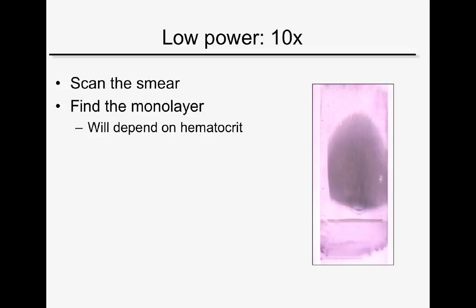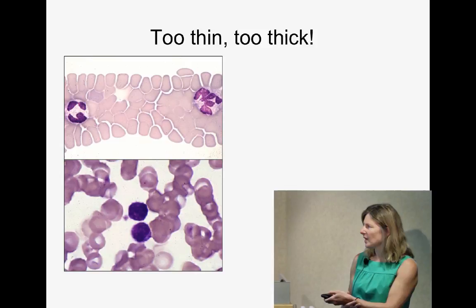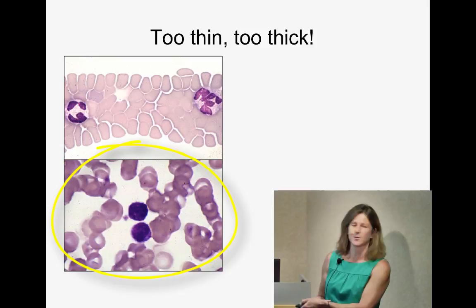Then find the monolayer. If the animal is anemic the smear is longer; if polycythemic, shorter. The monolayer is usually one or two fields back from the feathered edge. You want to see red cells dispersed nicely and leukocytes well spread so you can identify them easily. Too close to the feathered edge is too thin and cells distort. Too far back is too thick and cells are unidentifiable — one of the biggest mistakes beginners make is looking too far back in the smear.